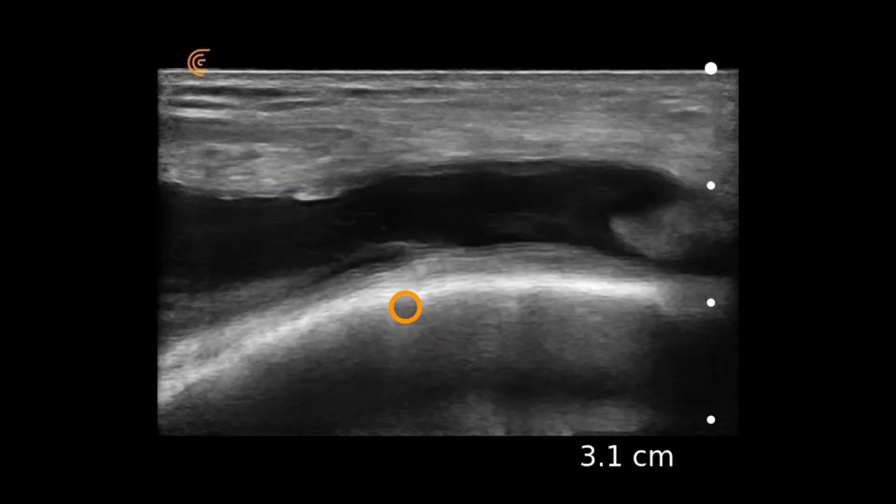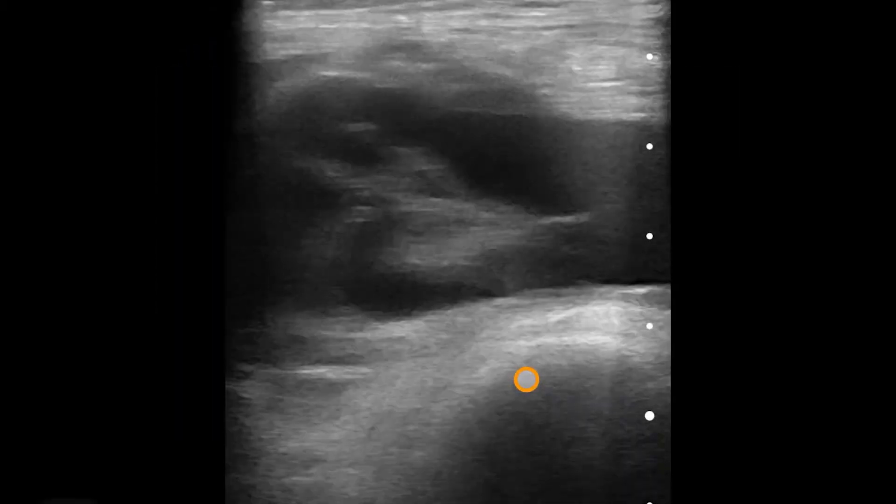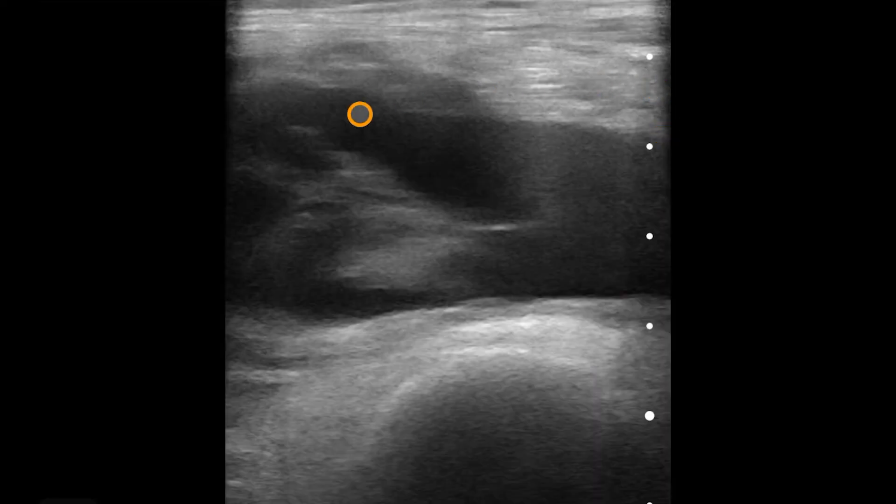We can further take that probe and rotate transverse, where now we have the femur here, and this is the suprapatellar bursa in transverse. Here's the quadriceps tendon superficial to it.